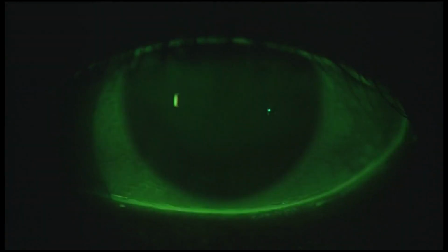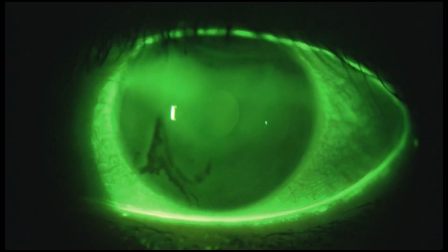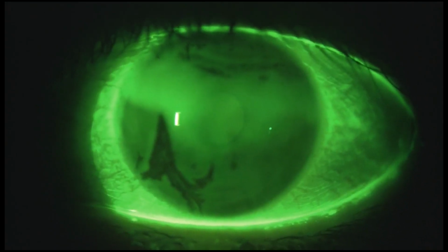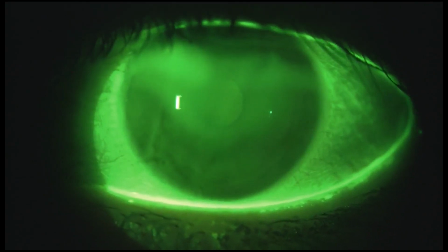What you see here is a video capture of fluorescence used to measure the thickness of a person's tear film. The darkening patches indicate a thinning tear film that causes increased salt concentration, leading to discomfort and potential cell damage. While this dry eye syndrome afflicts tens or perhaps hundreds of millions of patients worldwide, there are few automated tools to help ophthalmologists with detection, diagnosis, and selection of treatment.